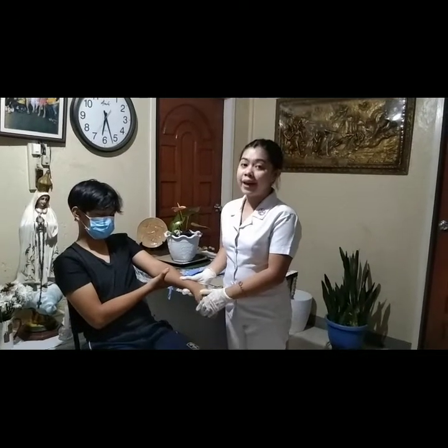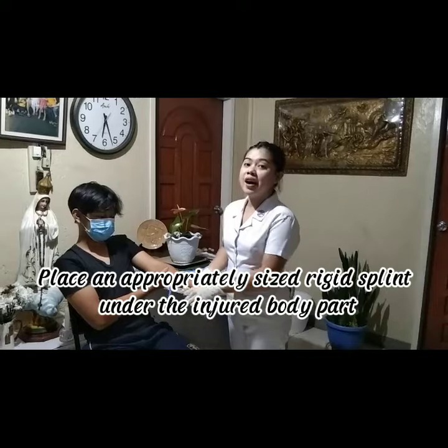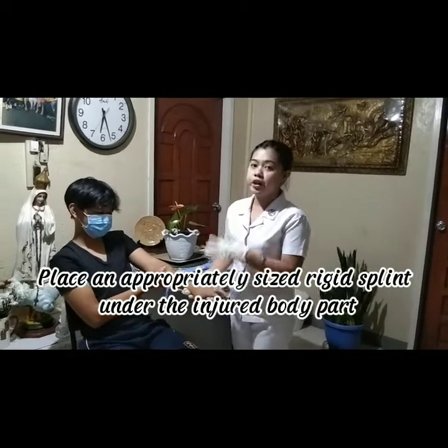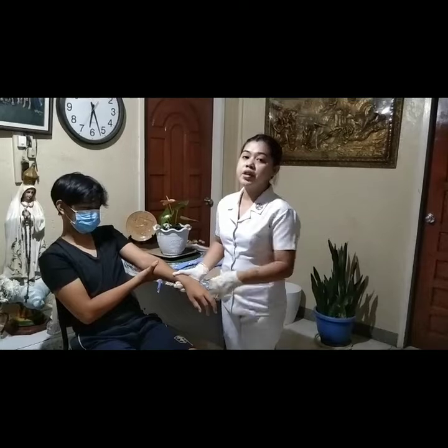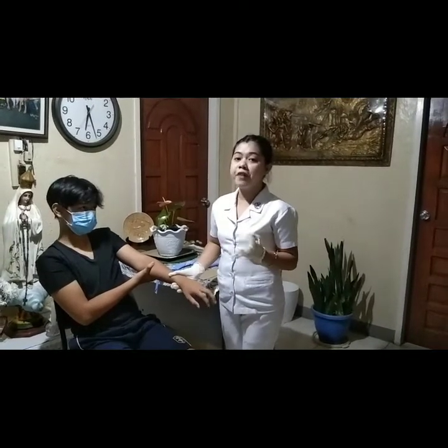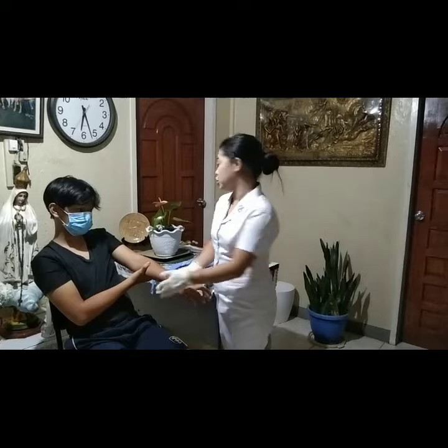Step 6. Place an appropriately rigid splint or any padded board under the injured body part. This will support the injury and prevent further damage.